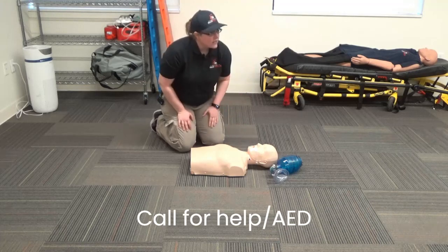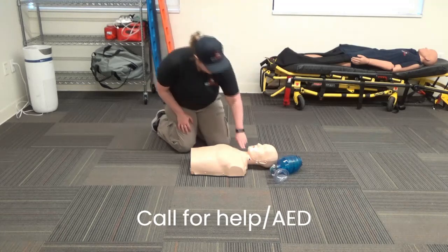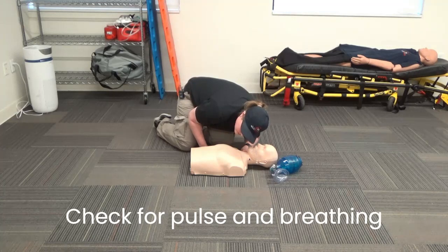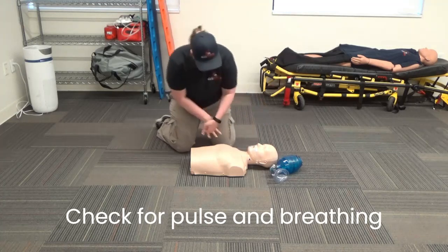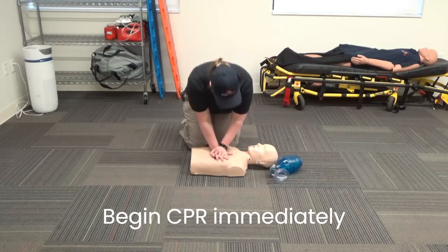Call ALS. Get an AED. I'm going to check for pulse and breathing — the AED is on the way. You feel no carotid pulse and you see no signs of life or breathing. No pulse or breathing. I'm starting CPR.